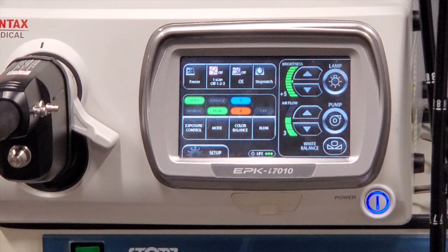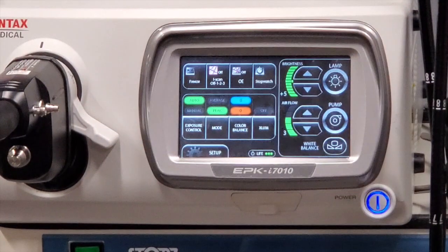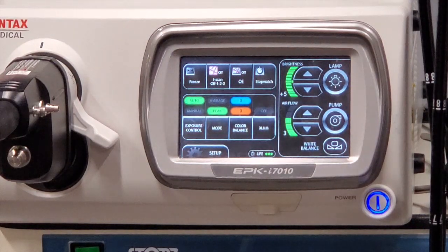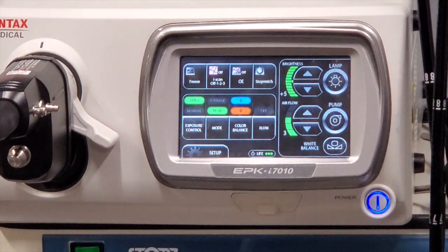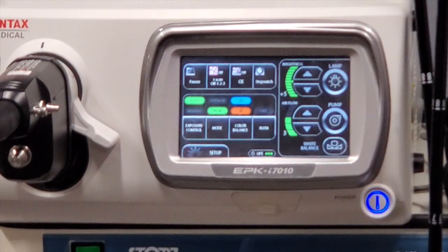Hey there, Andy Parker with Lucid Equipment. We have an EPK-I7010 we're going to test for you. Its serial number is UA010184 and it was manufactured in 2016. We're going to run through some of the buttons, not all of them. If you need anything in particular tested, just call us and we're happy to either make another video or do a video call, whatever you like. The unit is in perfect condition — there are no blemishes.